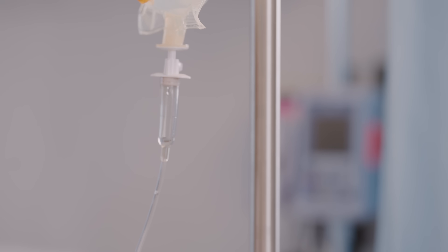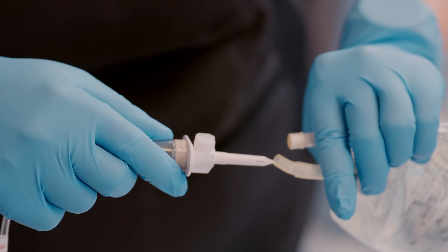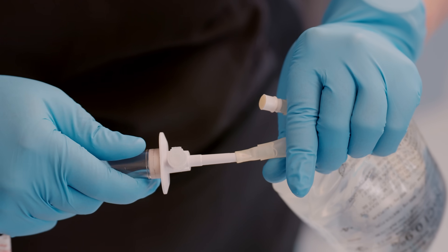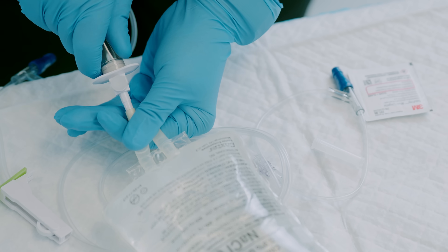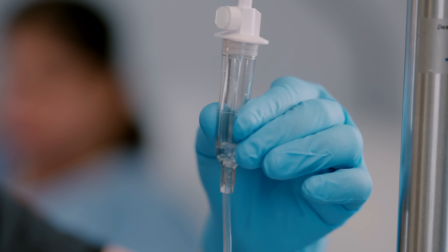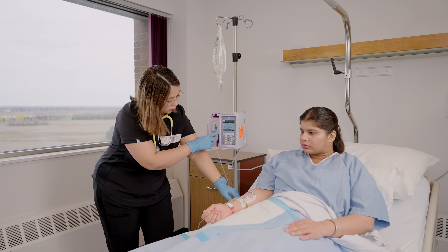Before we learn about the pumps, let's talk about spiking the IV bag. Spiking the IV bag means you will be penetrating the IV bag with the spike of an IV tubing into the spiking port of the IV bag, so that the content can flow into the IV tubing and then into the patient.